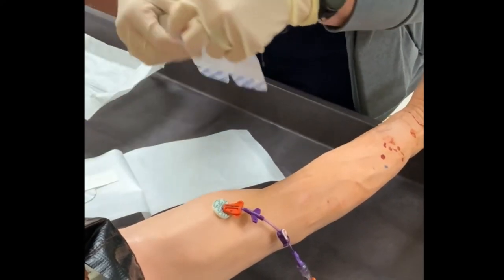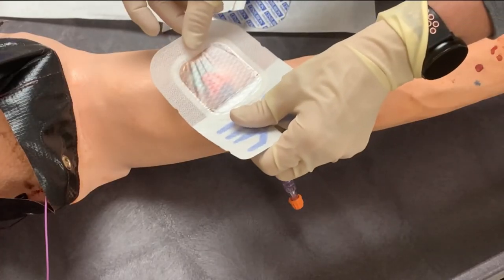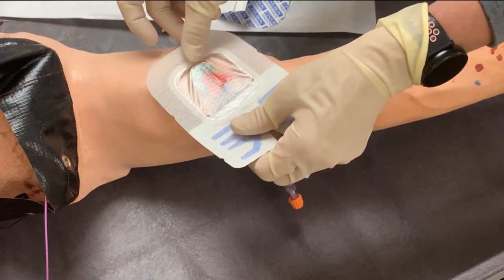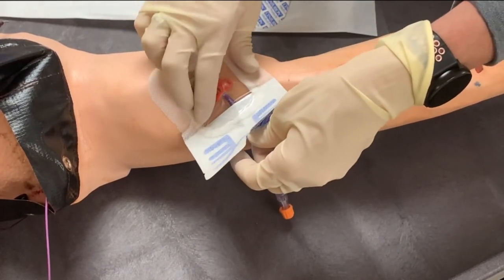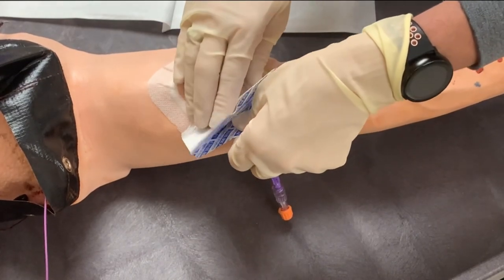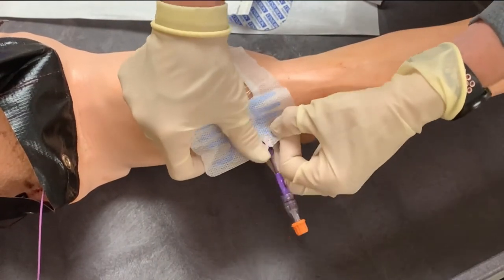The shirt portion of the dressing goes on first. It is the large piece with the window in the middle. Position the dressing so the window is over the insertion site. You should be able to see the biopatch, SecuraCath, and if possible, the winged hub of the catheter in the window. Do not stretch the dressing over the site, but lay it firmly in place and gently press on the edges to adhere it to the skin. If you stretch the dressing, it will apply more pressure than you want to the catheter, and that could potentially cause device-related pressure injury.